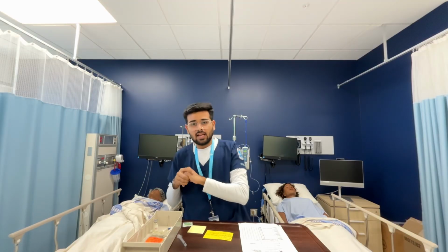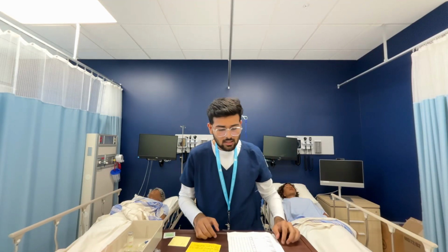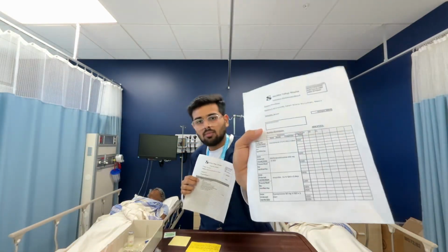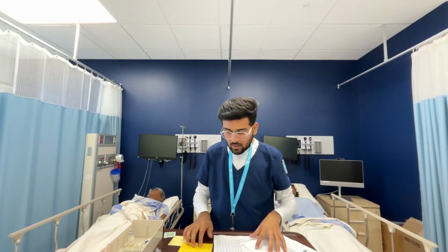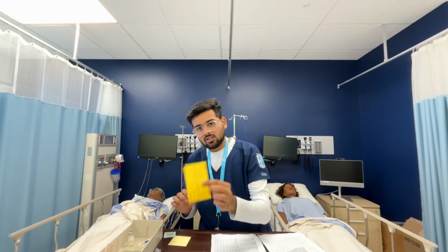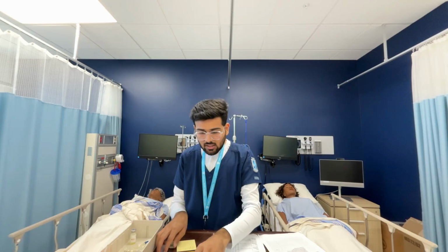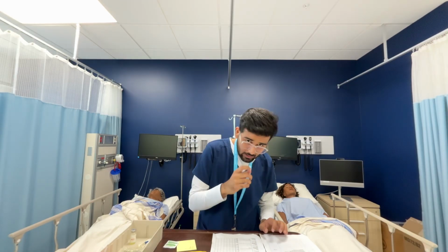I'm going to perform my hand hygiene and I'll start with my verification check. Before we begin, I'll just show this is my doctor's order. This is my MAR. So I'm going to do my verification. I have my supplies. This is my drug card. Here are my medications, and here are the other supplies I need for the assessment.